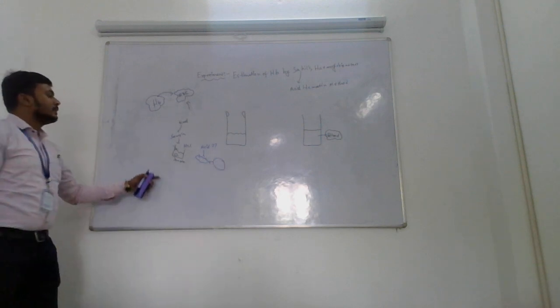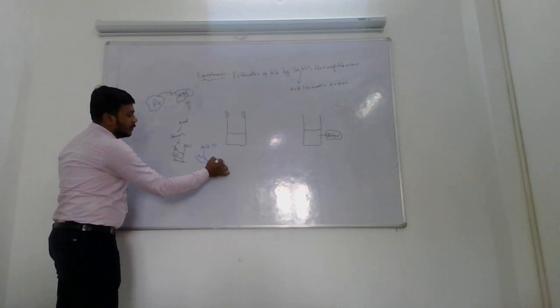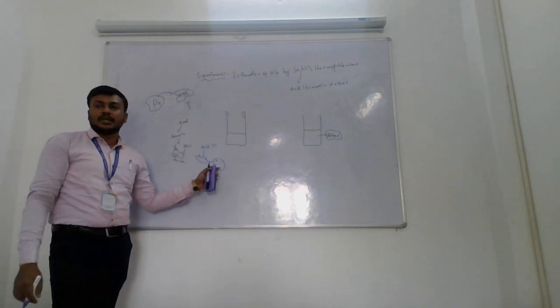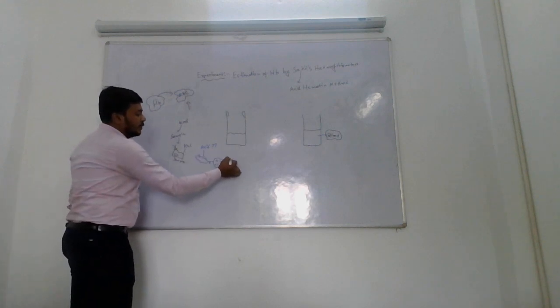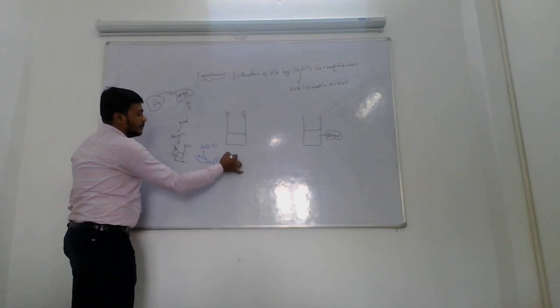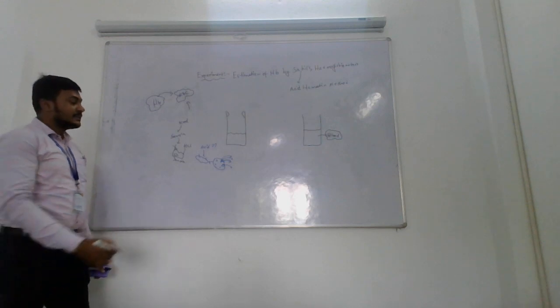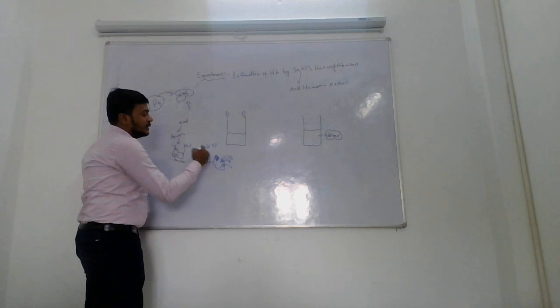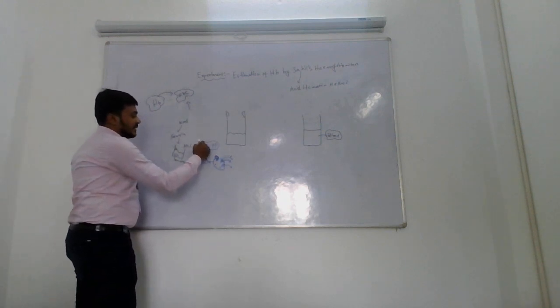Now, looking at the concept of hemoglobin, it is present in the RBC, more specifically on the globin chain. So if I need to estimate hemoglobin, I have to remove it from the RBC. That is the specific purpose for the breakdown of the RBC, and for that we use acid.